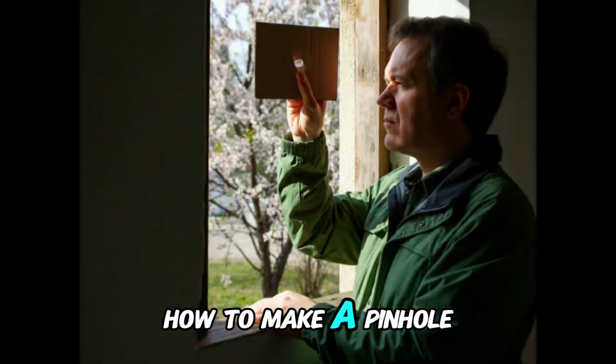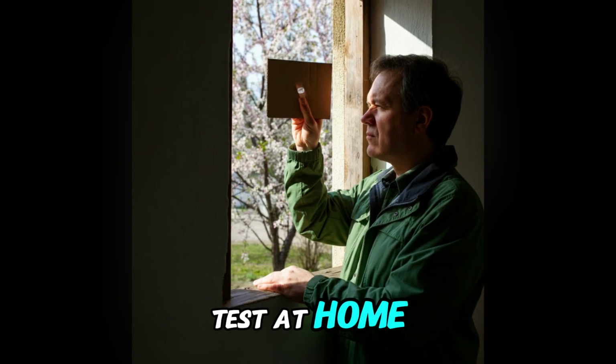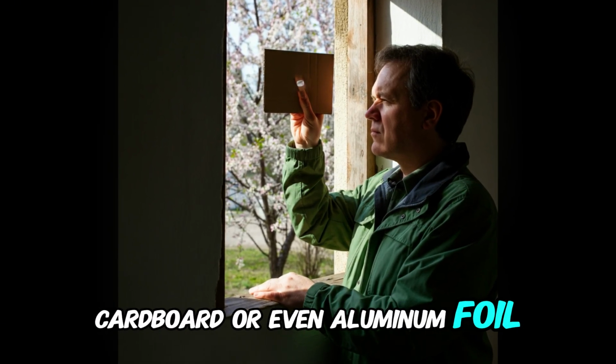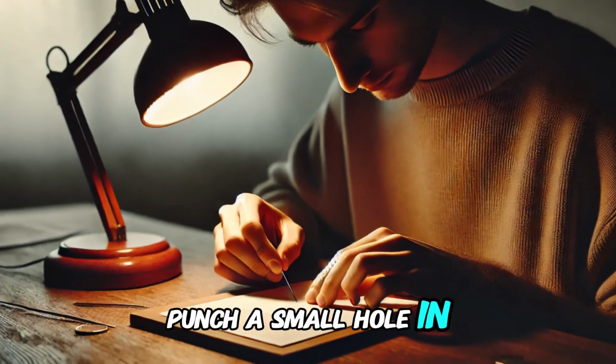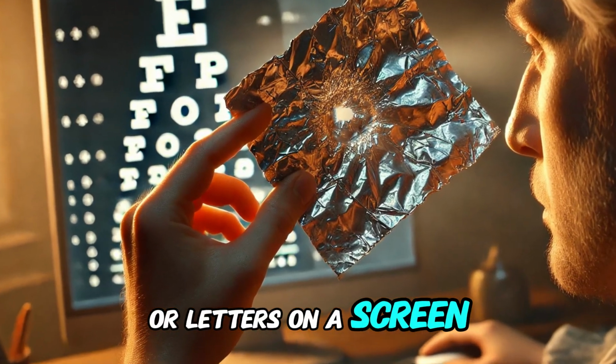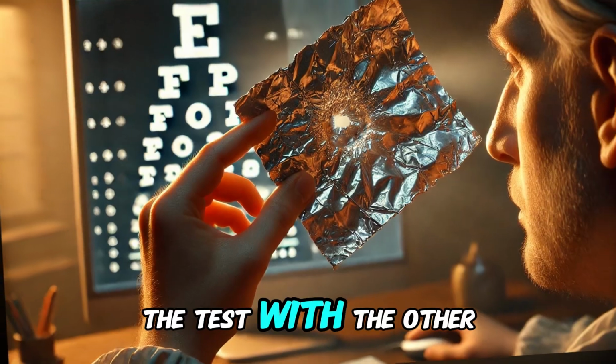How to make a pinhole test? At home, take a piece of paper, cardboard or even aluminum foil. Punch a small hole in the center about 1 to 2 millimeters wide. Look through the hole at a distant object or letters on a screen. Cover one eye and repeat the test with the other.